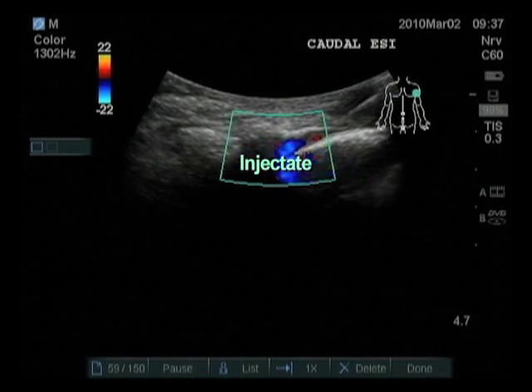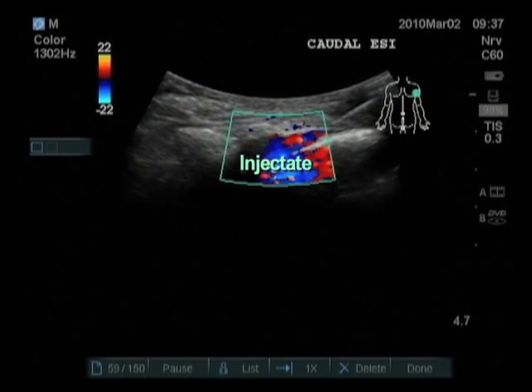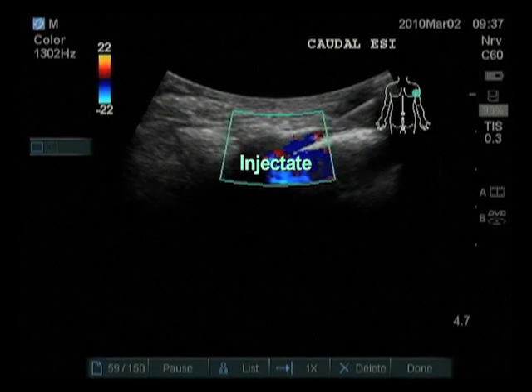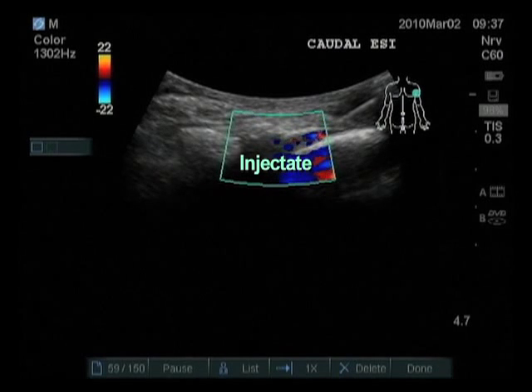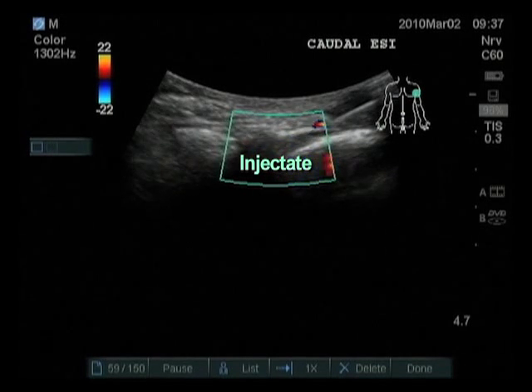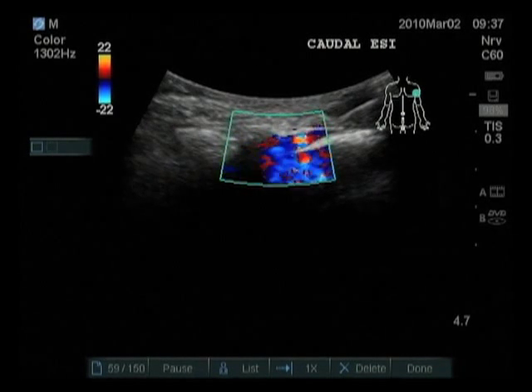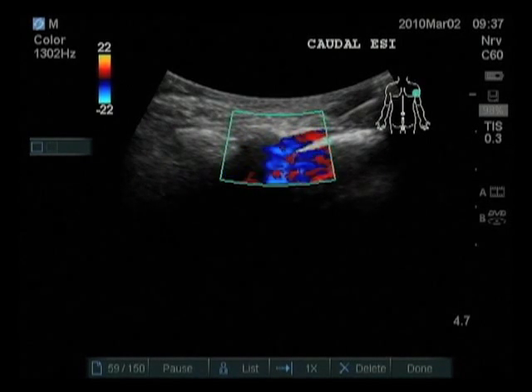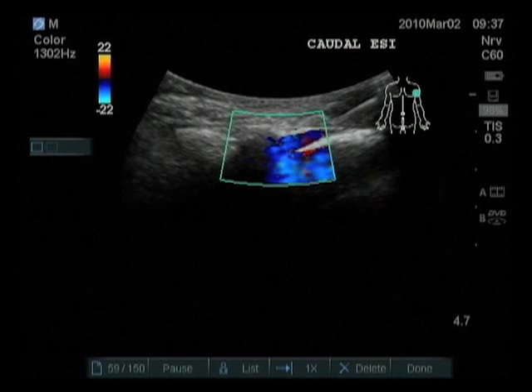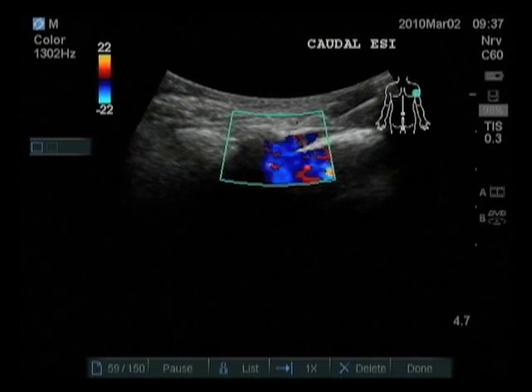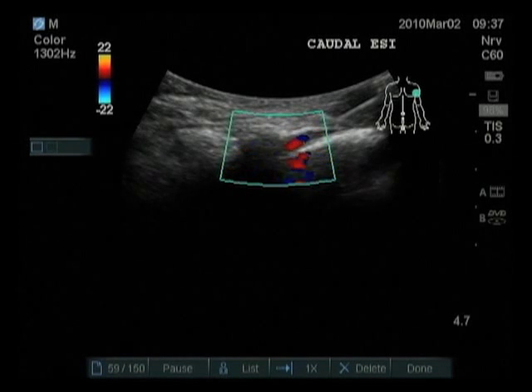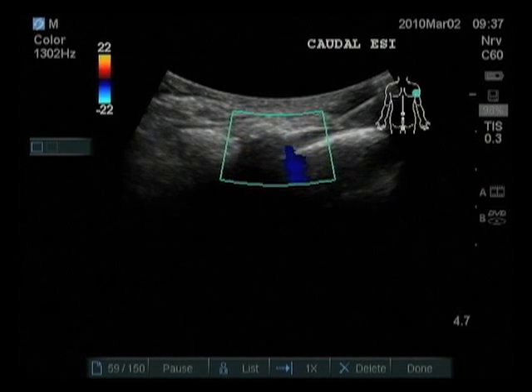Once the injectate enters the canal, the color Doppler shows the fluid perturbation confined within the sacral epidural space, indicating a successful injection without need for contrast or x-ray.